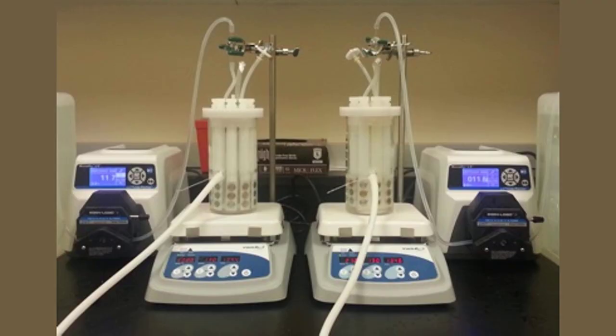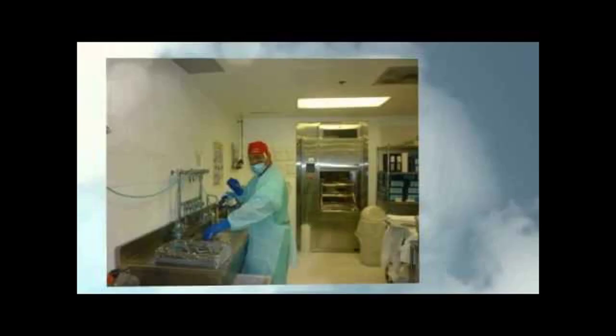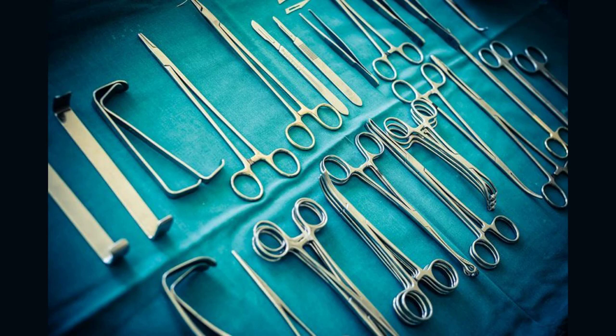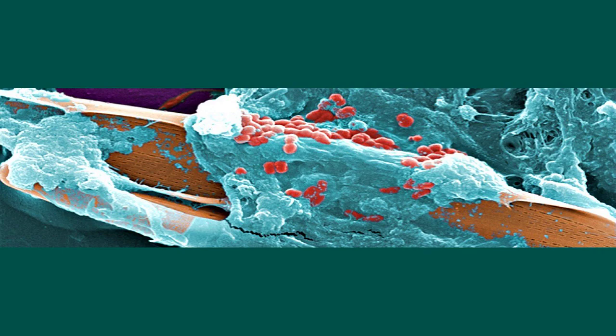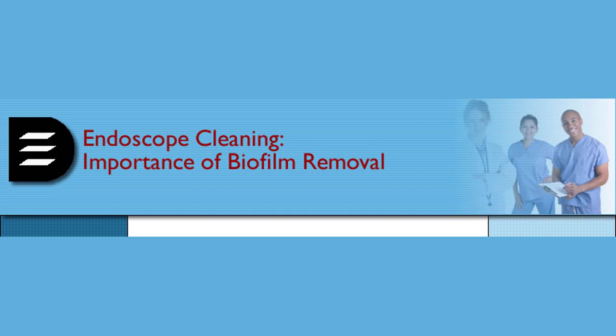Since staff can inadvertently cause biofilm to form, it's best if medical facilities routinely retrain them. Surgical equipment cleaning often relies on the manufacturer's instructions for use, IFU, so they should familiarize themselves with it to ensure they do everything correctly. An enzymatic soak helps break down contaminated microorganisms and makes surgical instrument cleaning much more manageable.